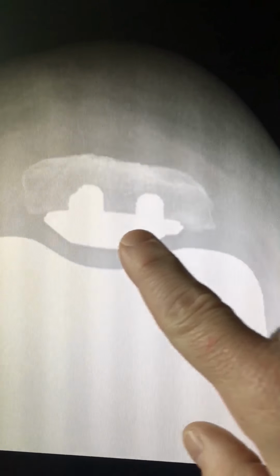Postoperatively, we've now resurfaced her patella. You can see that it's tracking well within the femoral implant. This is a cementless patellar component. So you see the metal portion that affixes it to the bone. This space is filled with polyethylene, which is obviously much less painful against a metallic implant. And this has led to her pain-free recovery.